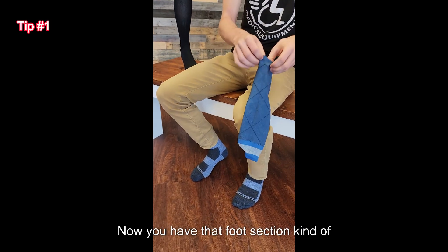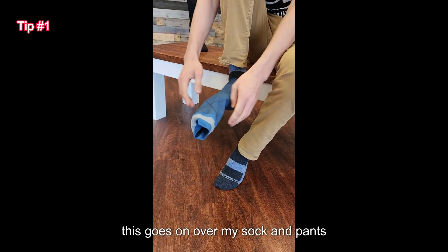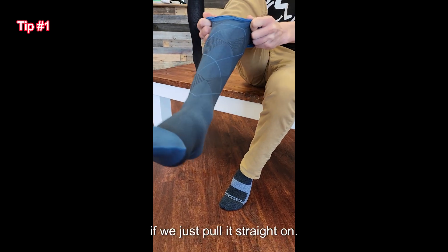Now you have that foot section kind of inside, and watch how easy this goes on over my sock and pants if we just pull it straight on.